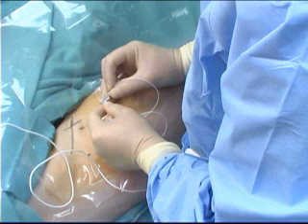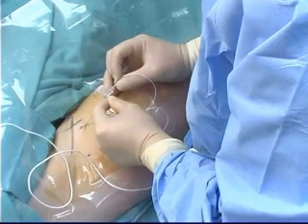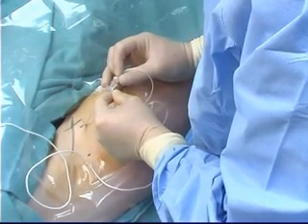If the catheter is placed without quadriceps stimulation during catheter advancement, it simply means that the catheter is not on or near the nerve, and the block cannot be expected to be successful. If required, the catheter can be advanced until adduction of the thigh due to obturator nerve stimulation is observed, but this maneuver is usually not necessary since the spread of local anesthetic agent will be cephalad along the femoral nerve if the catheter is properly placed. Remove the needle without disturbing the catheter.